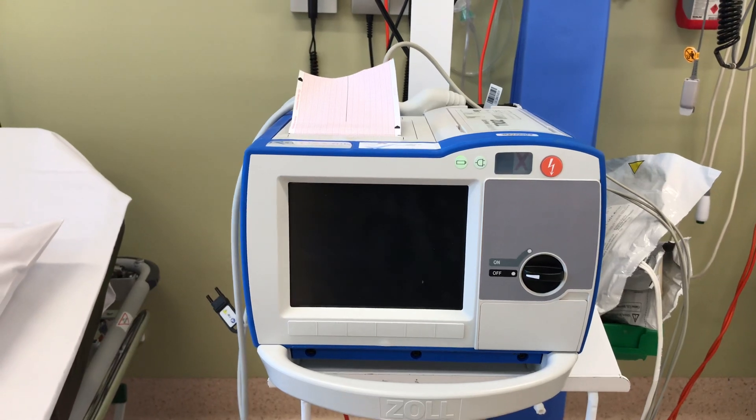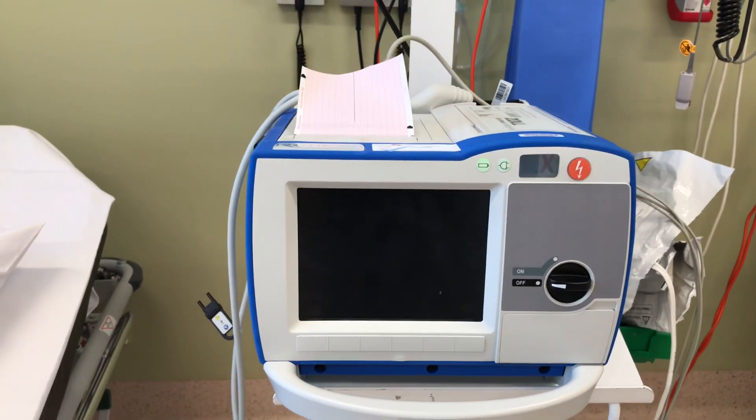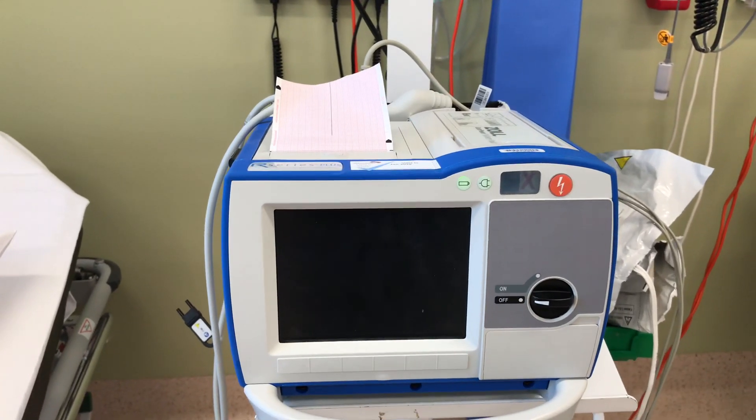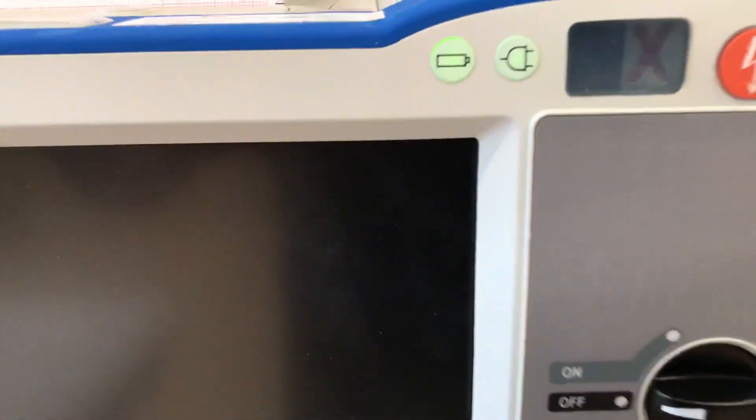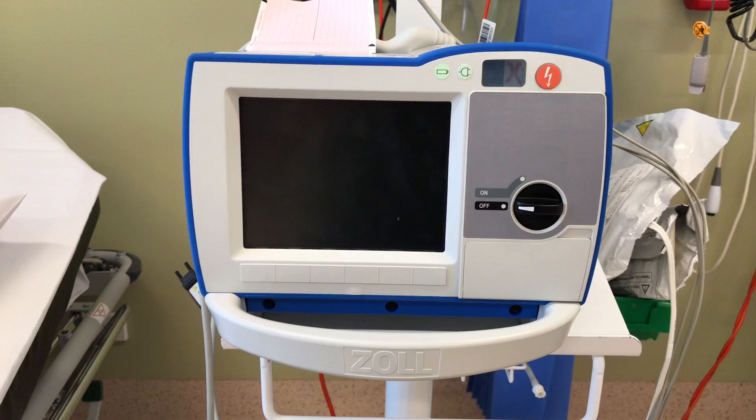This video is particularly for the ones who haven't attended the testing with myself. And as you can see, there is an X symbol, which means this device is actually due for a calibration or a test.